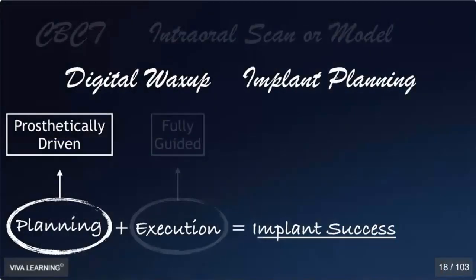Once we have our diagnostic information, we have enough and we're ready to go ahead and do our digital wax up. And I think that by going through this process of planning implants from a digital perspective, it's really important to have a full digital wax up. And I'll show you a little bit of evidence that we've discovered about why. And from there, we can take that information and we can go ahead and plan our implants from a surgical perspective, of course, digitally prior to surgery, putting all of those things together.